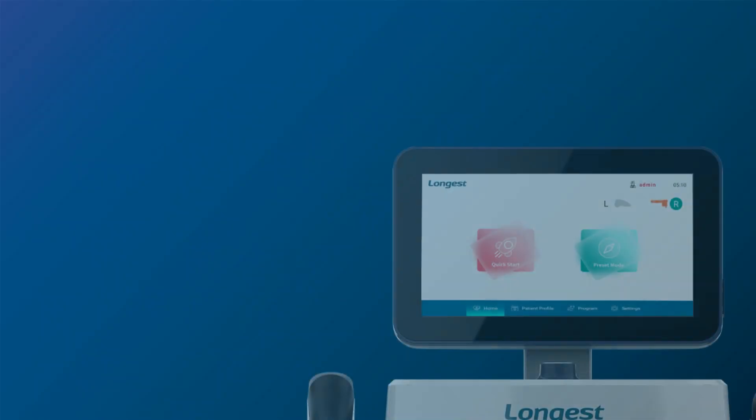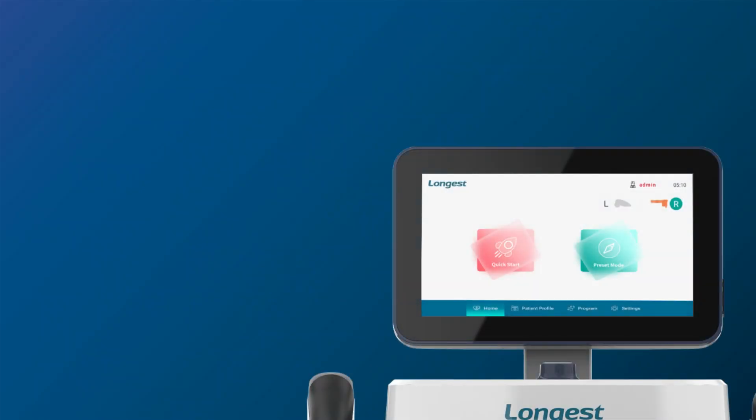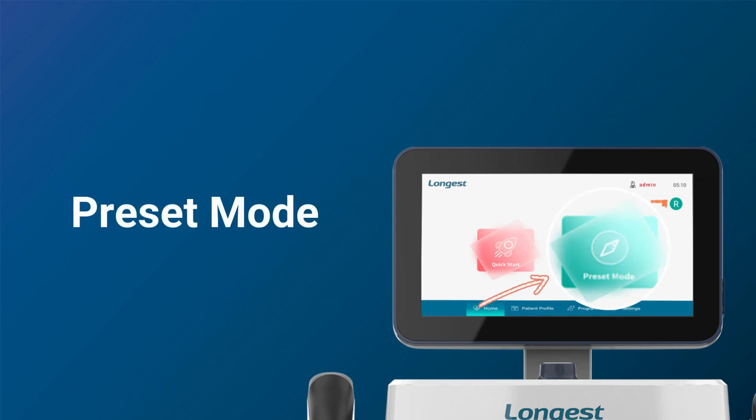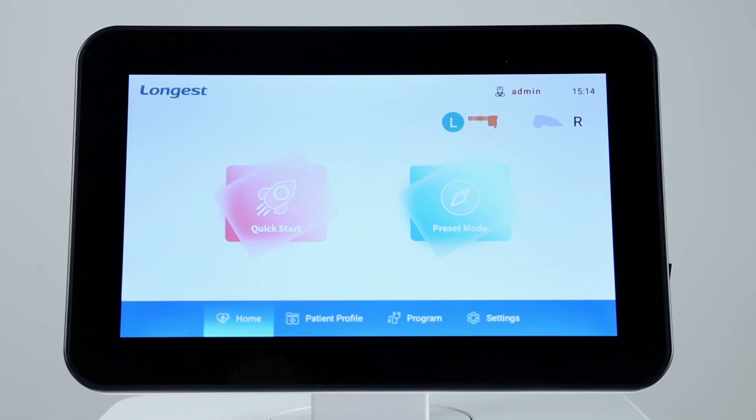Above is the operation process of quick start mode. Now, let's walk through the process of preset mode.